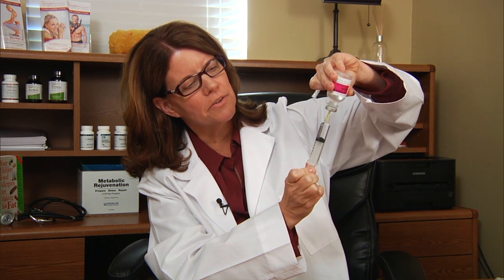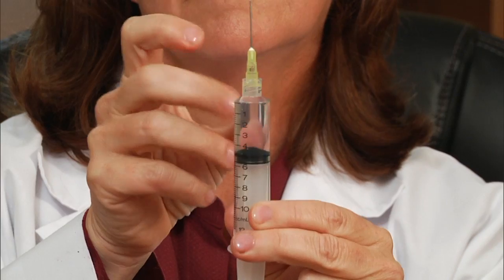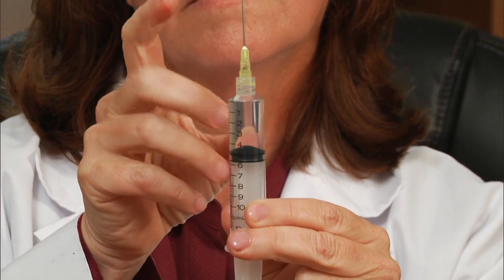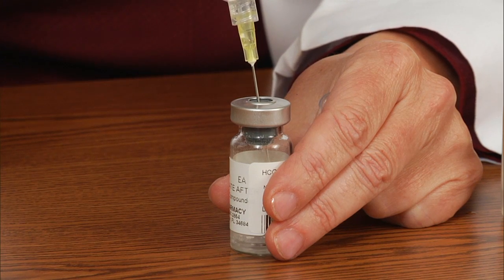Pull a little bit more so that you can get rid of air bubbles, then take it out. What you want to do is get those air bubbles to the top of the syringe. We're on the five marker for the water.